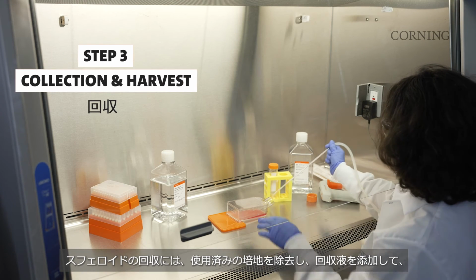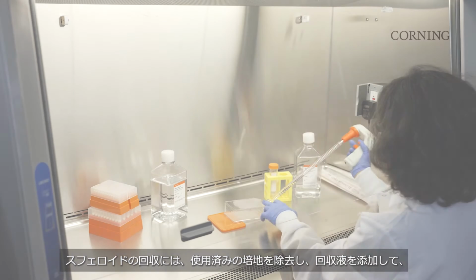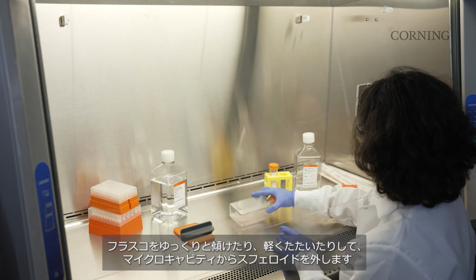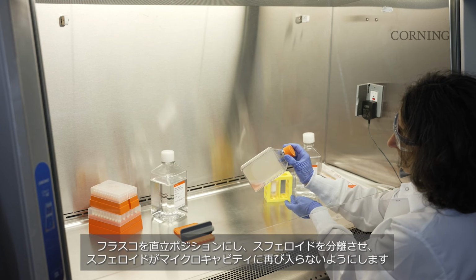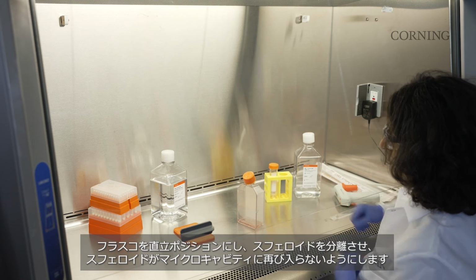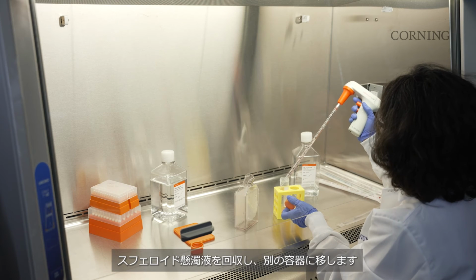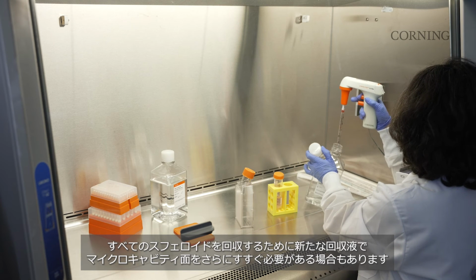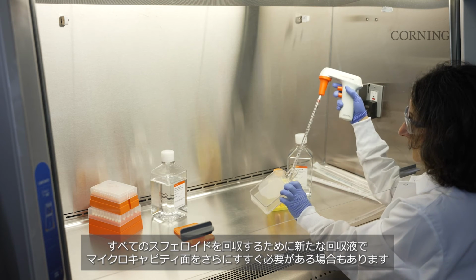For spheroid collection and harvest, remove spent medium, then add desired collection solution, and gently tip, tap, and swirl the flask to dislodge spheroids from the microcavities. Bring the flask to the upright position to release the spheroids from the microcavities and prevent them from resettling. Spheroids can be collected and transferred to a separate collection container. It may be necessary to perform additional rinses of the microcavity surface with fresh collection solution to recover all spheroids.